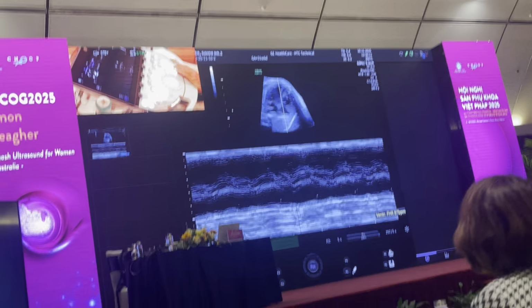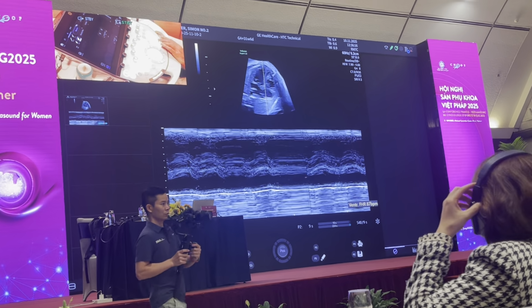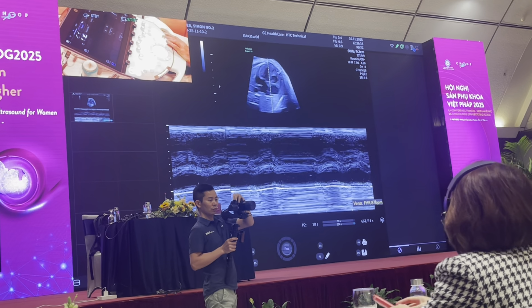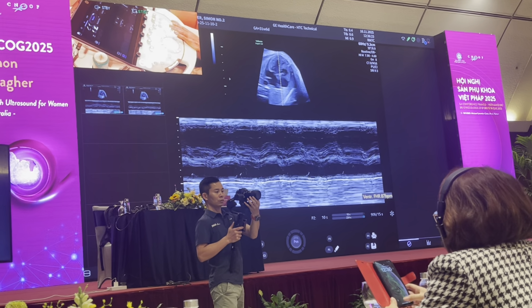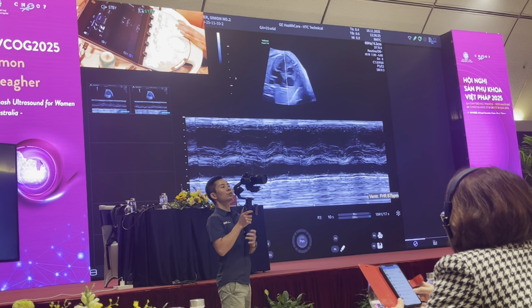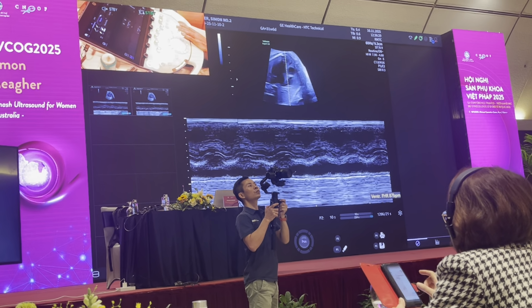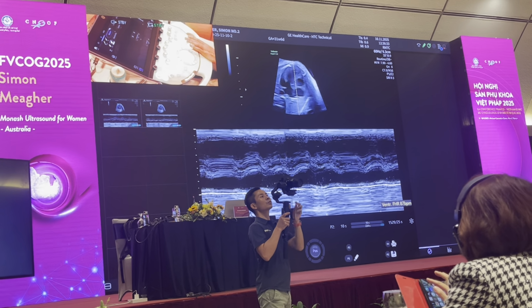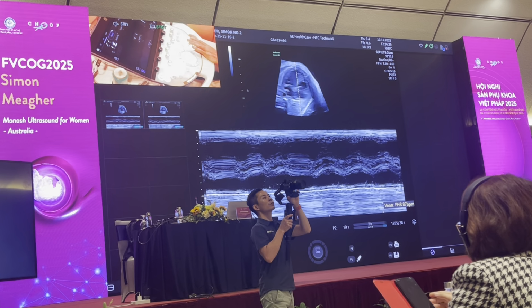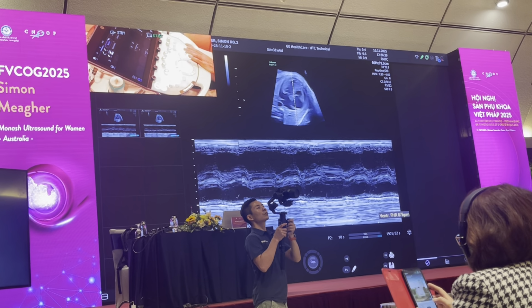While the baby is having the ectopic beats, I just want to catch it before it changes. Sometimes the baby goes in and out of cardiac rhythm disturbances. What I'm seeing in this baby is intermittent premature atrial ectopics. And the question is how often or how intermittent? Is it every second beat, third beat, fourth beat, or is it variable?